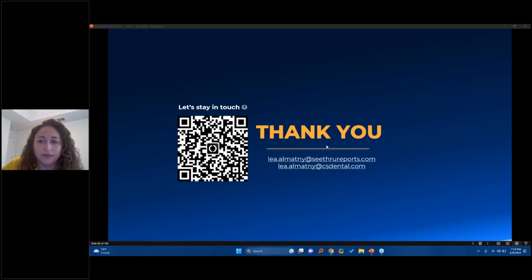Yeah, that's correct. And also taking the high res at a larger size, which is huge if you wanted to do that, up to a 10 by 10. Correct. Okay. And also that one question about the resolution being noisy sometimes.